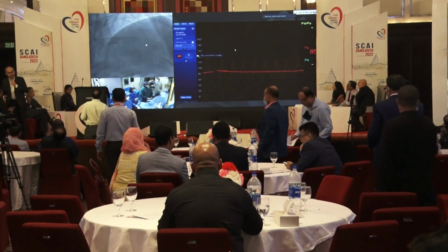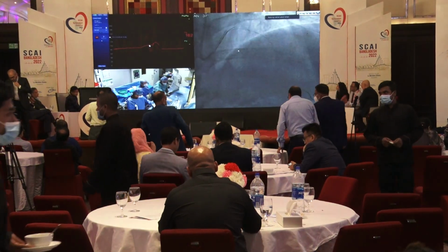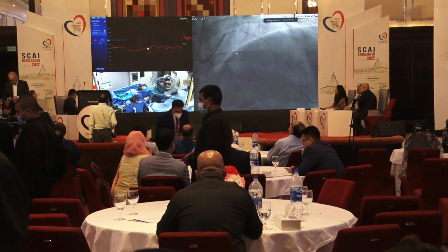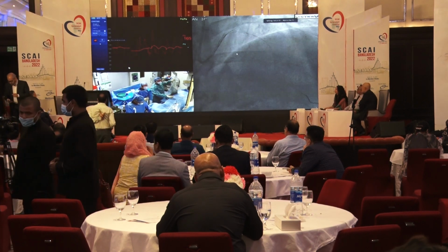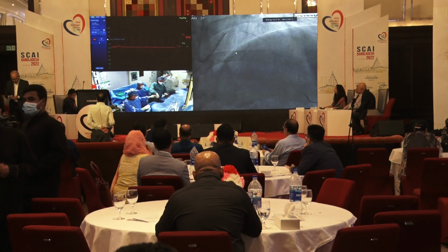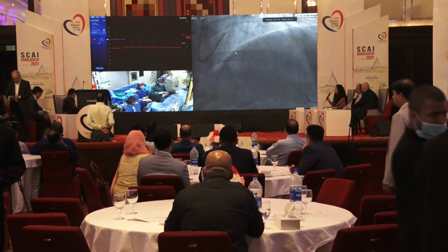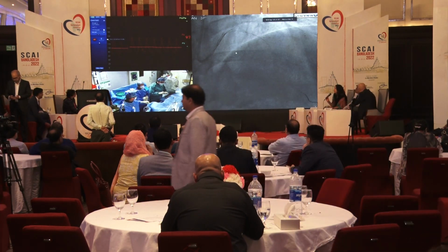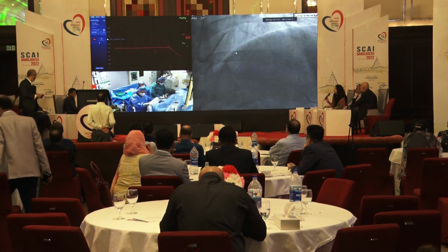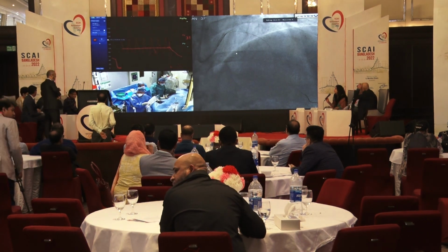Antonio, what do you think about the recent guidelines saying bypass surgery for diffuse LAD disease? I think this patient is not diabetic, the symptom score is relatively low. I think there is nothing wrong to do bypass surgery, but I think this LAD can be treated also with PCI.